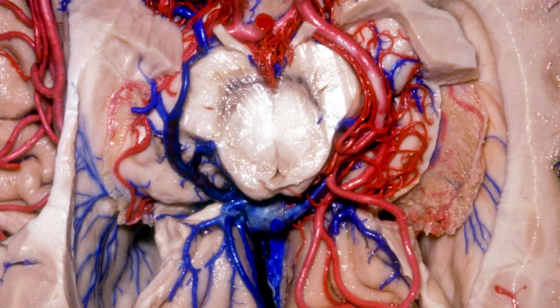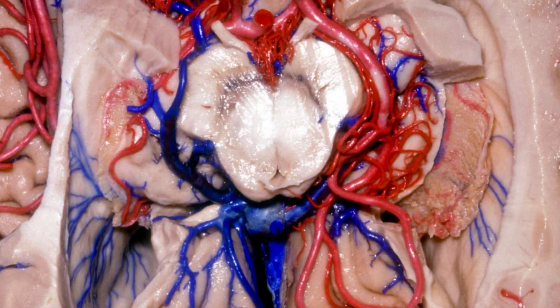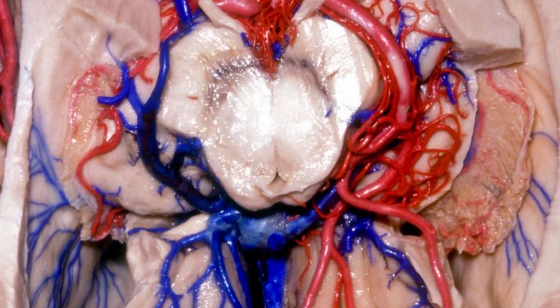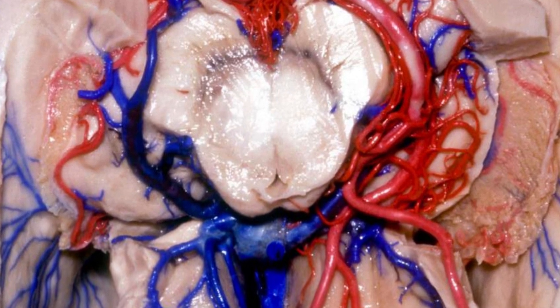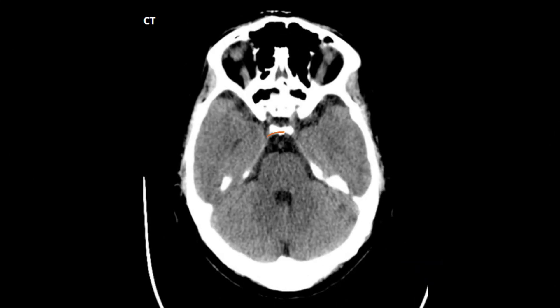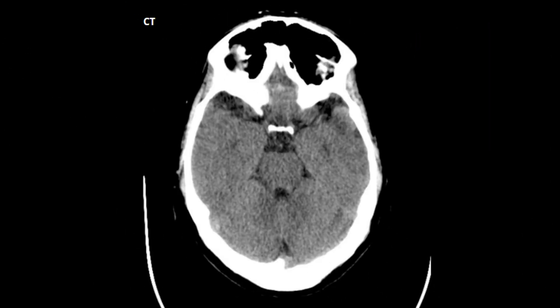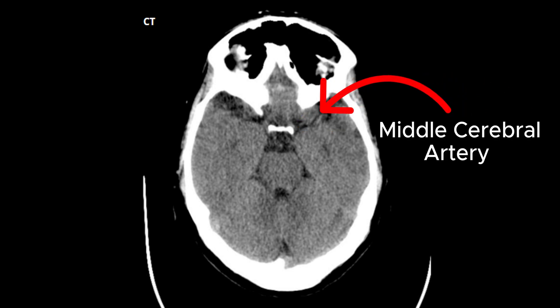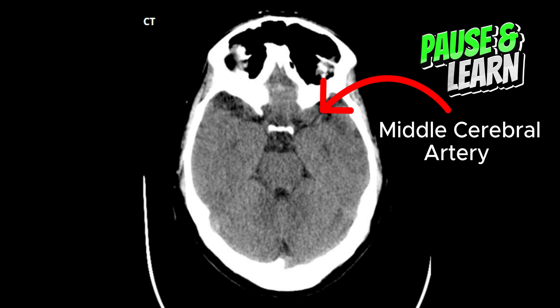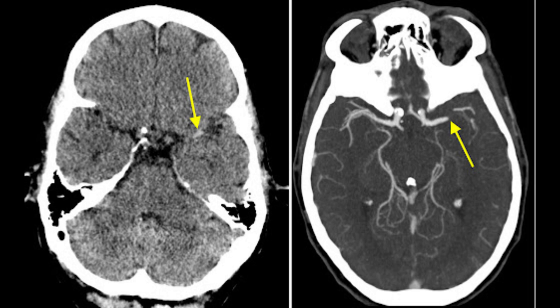As we discussed in the previous video, blood vessels lie safely in these cisterns, and sometimes these vessels can be visualized on a good quality CT scan. The basilar artery appears as a dot-like structure in the peripontine cistern. The MCA, or middle cerebral artery, can be seen in the sylvian cistern as a white linear structure. Here is another image showing the MCA.